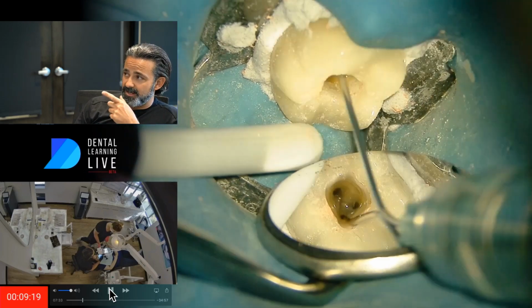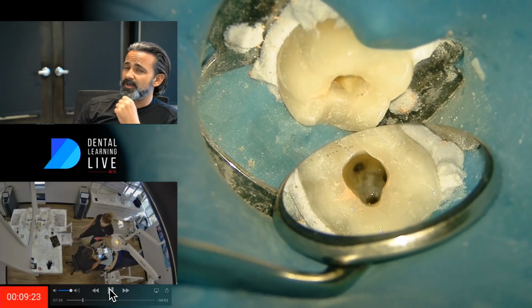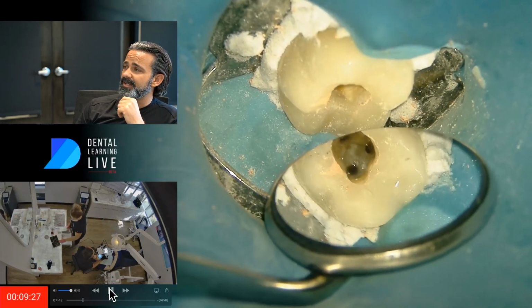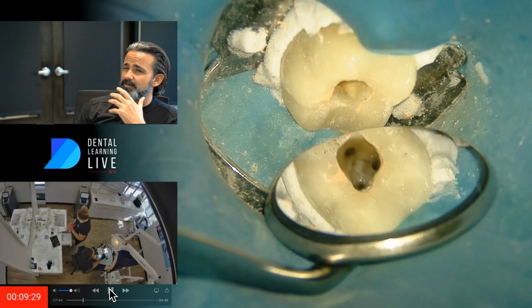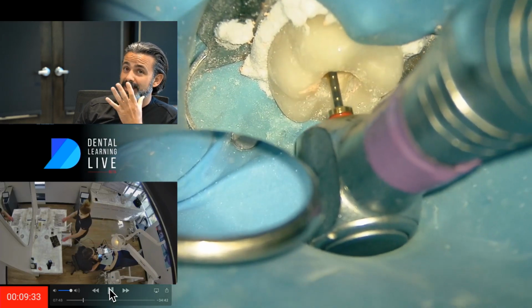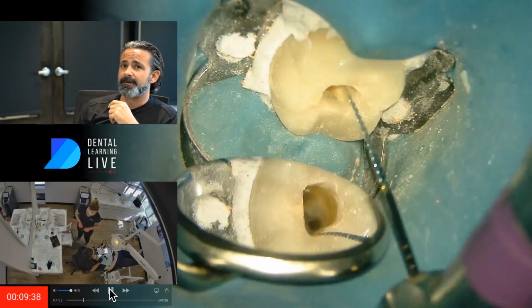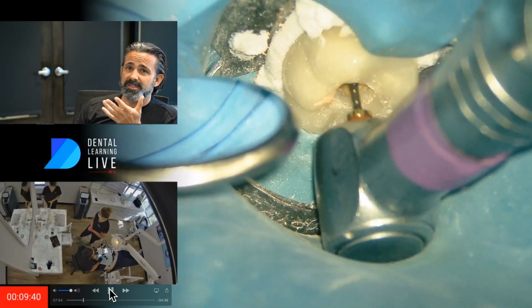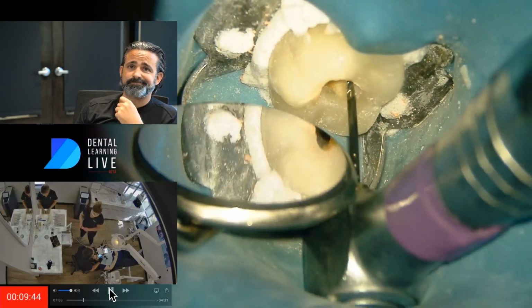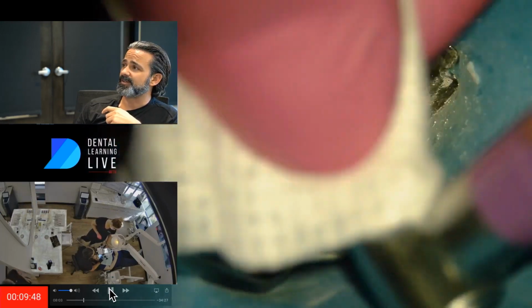And now what I've done is I've switched over to isopropyl alcohol. I'm going to try to ball it up and then pass an instrument through it and see what else comes out of there. It's looking pretty clean. Again, look at that mesial isthmus, not much present. So I'm getting a little worried. There's a little bit more gutta percha here. That there really is an isthmus present, and I'm not dealing with some sort of periradicular infection, extraradicular infection, I should say.